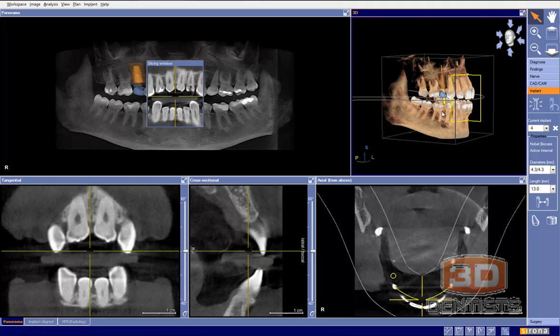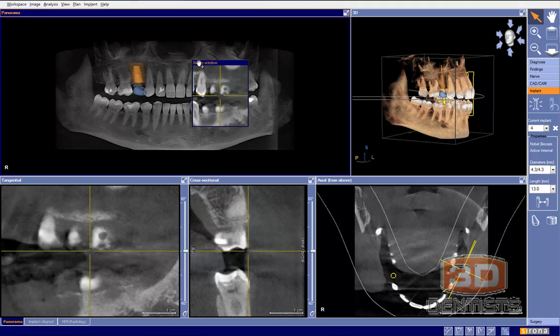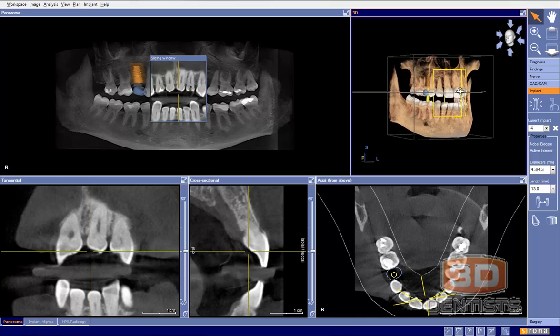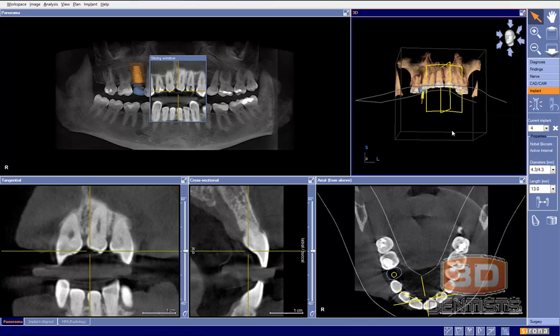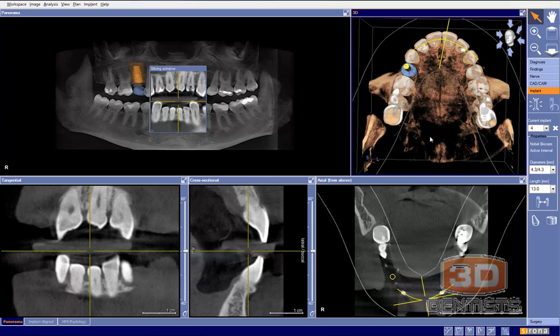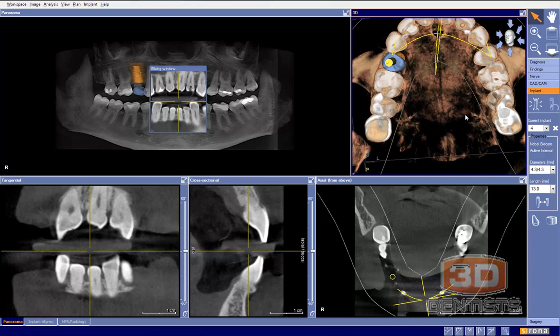So this case was sent to us to evaluate the plan done on site number 4/5. Patient's missing one of the premolars. So let's go ahead and take a peek at it. As we have CEREC data here, we can take a close look and better understand exactly what is going on here.